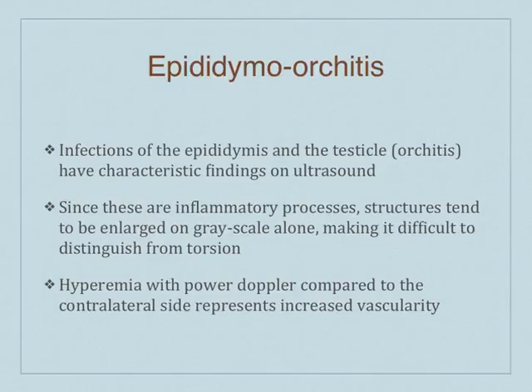We can also look down in the nether regions, down in the testicles and the epididymis. We can see infections down there.